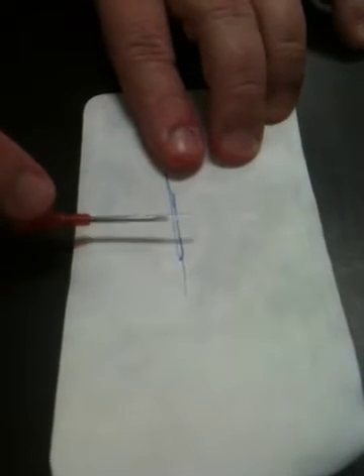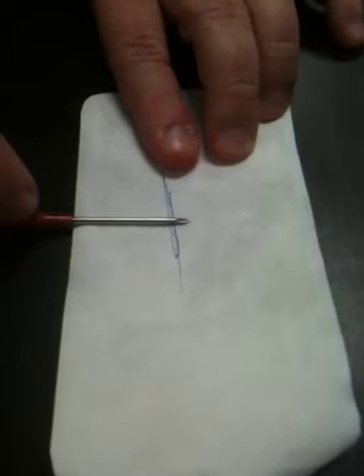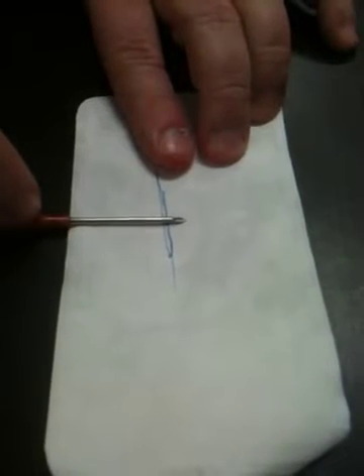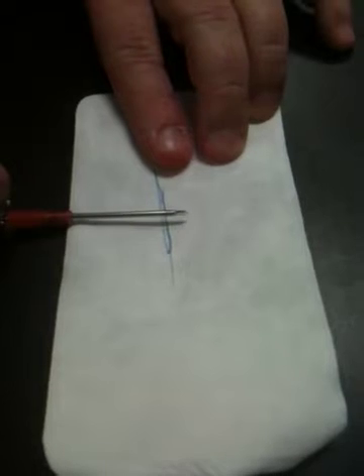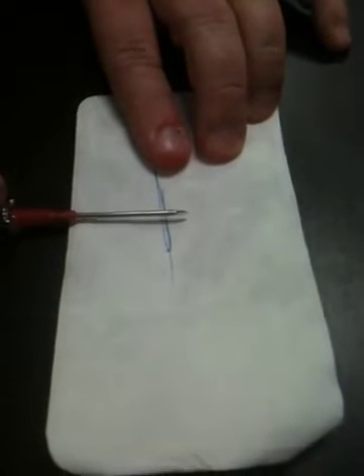As opposed to, we get in, we go just a little bit further to get the cannula seated in, then we're feeding the cannula off of the needle.